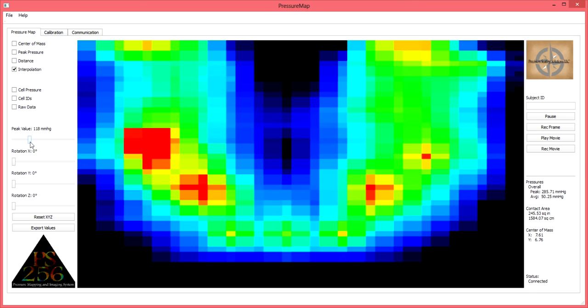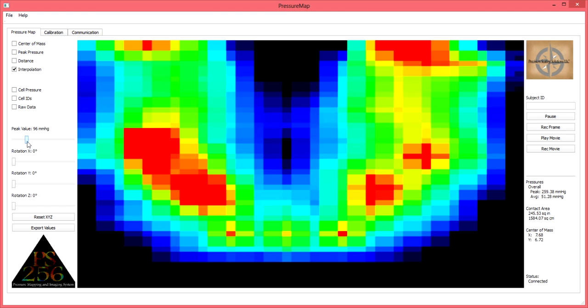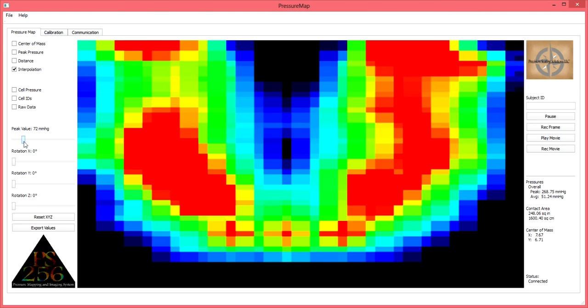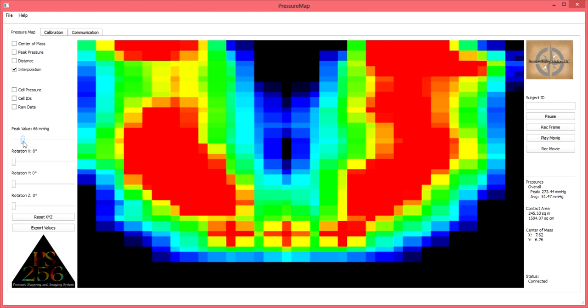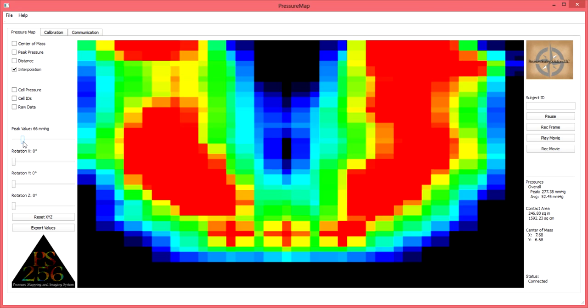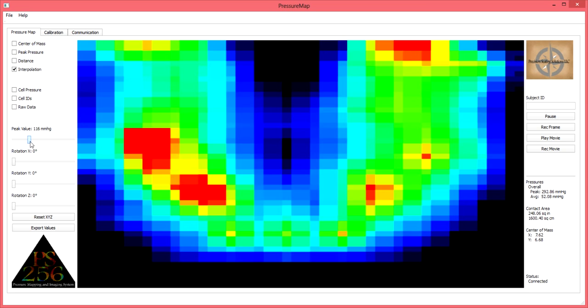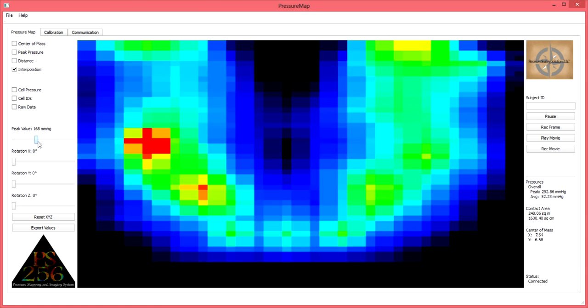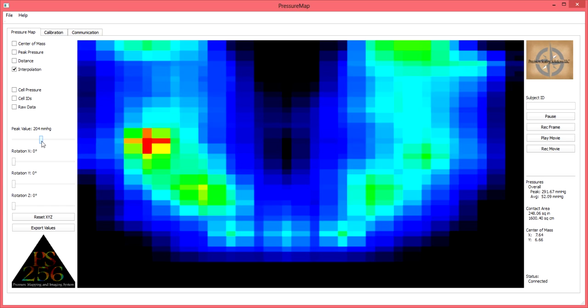If the peak value slider bar is slid to the left, the peak value number on the top of the slider bar will decrease and an increased area of redness and hot coloration will appear. If slid to the right, the peak value number on the top of the slider bar will increase and an increase in cooler colors will be noted.